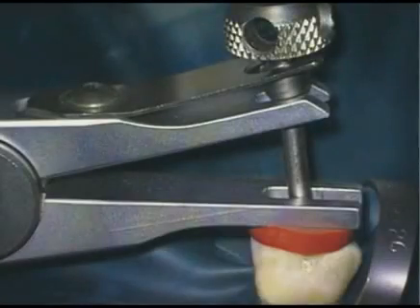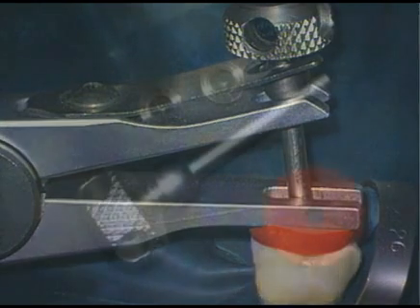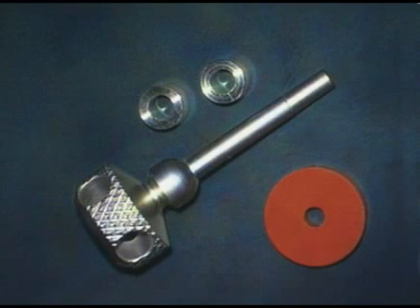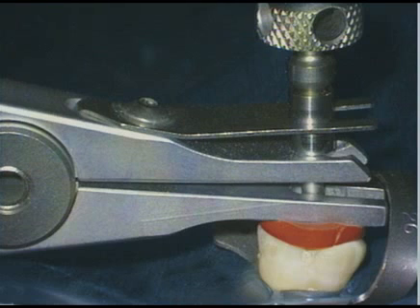In this show, we have seen the PRS in action several times. Let me make a suggestion for when the arms of the extracting plier are too far apart. In these instances, we're pulling the post undesirably off axis. To better direct the removal load forces on axis, we can use thin metal spacer tubes. These spacer tubes can be inserted onto the tap to bring the arms of the extracting plier closer together and better align the removal loads.